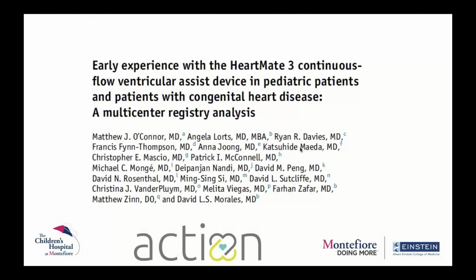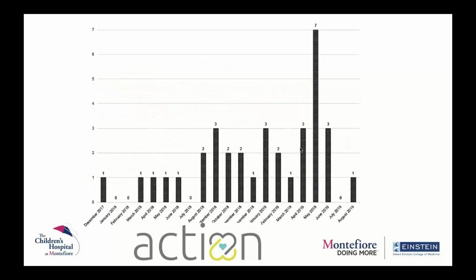So Action Network actually studied the HeartMate 3 in pediatric patients. And as you can see here, lots of devices were being implanted from 2017, when the device was initially approved, all the way to 2019, and you see this huge surge. So more and more centers are using HeartMate 3s in their adult sized patients.